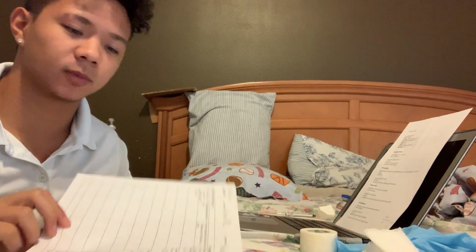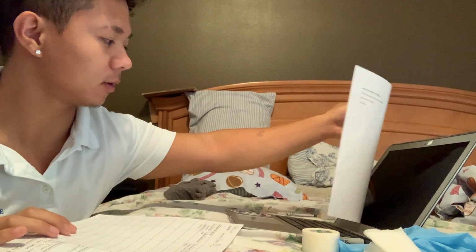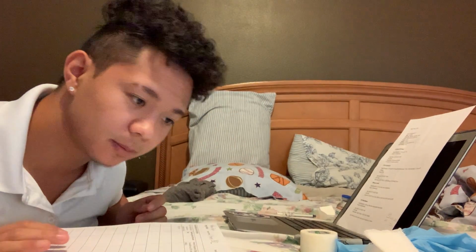Hi, this is Andrew Garcia doing the subcutaneous medication administration checkoff. So I have my vitamin B12 med sheet and the BMS paper chart for my medication administration record. And I'm going to begin.